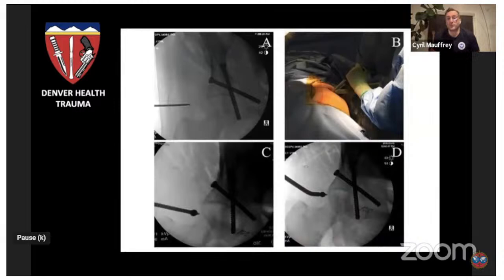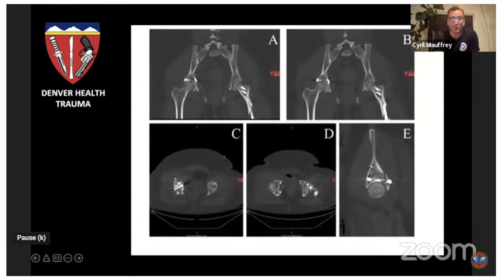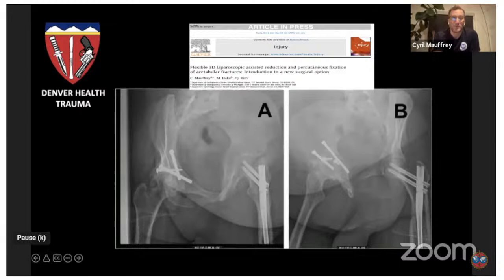And again, we did this percutaneously from the back with X-ray control, capturing that wall fragment and using cannulated instruments. You see the top left is a cannulated pig sticker that allowed me to reduce that wall fracture, push it in and compress it with some lag screws to fix it through a very small incision that avoided blood loss. Far from being perfect. I mean, I totally recognize that. I'm a pelvic surgeon and I'm not entirely proud of the quality of this reduction, but done all percutaneously with zero blood loss. And this patient did fairly adequately considering her injuries.